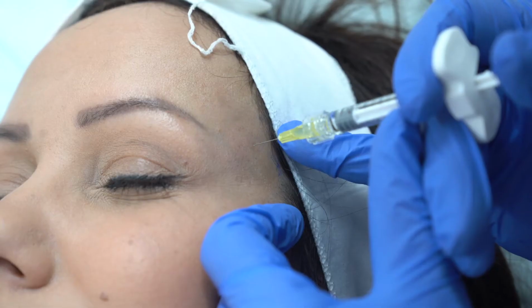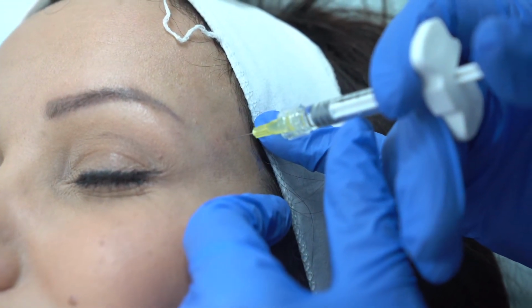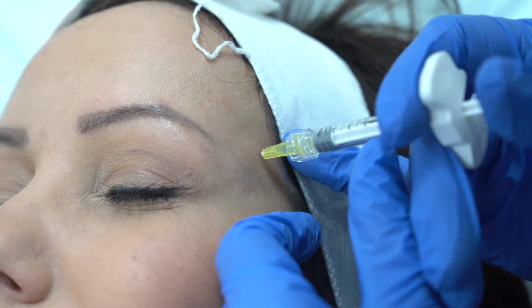This is my favorite layer, because it gives a smooth and gentle lift, and does not require as much filler as the deep supraperiosteal plane. But it will require more filler than the superficial fat plane. Aesthetically, this gives the best results. The challenge is to be able to identify that one has penetrated the deep fascia, and this is by feel. There is a pop sensation where the needle hits a resistance, and then it suddenly gives way.